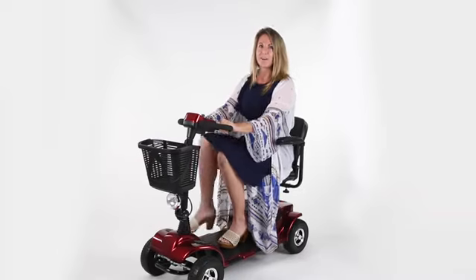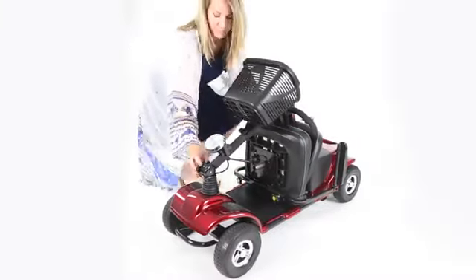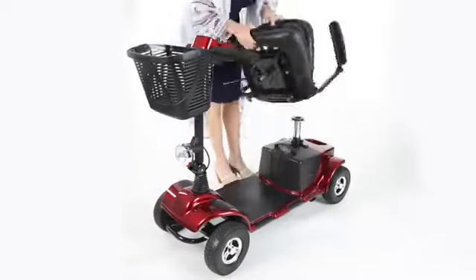First, I want to point out that the scooter breaks down into multiple pieces, making it ideal for travel and ease of use. It's just as easy to break down as it is to put back together.